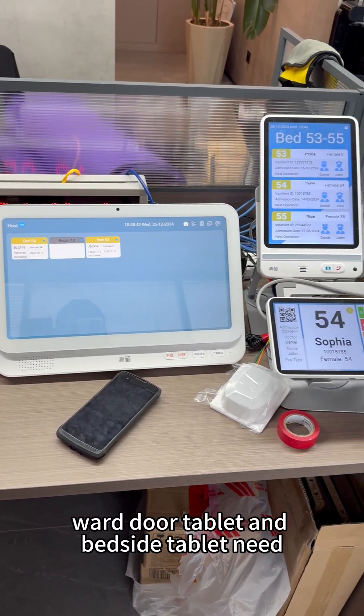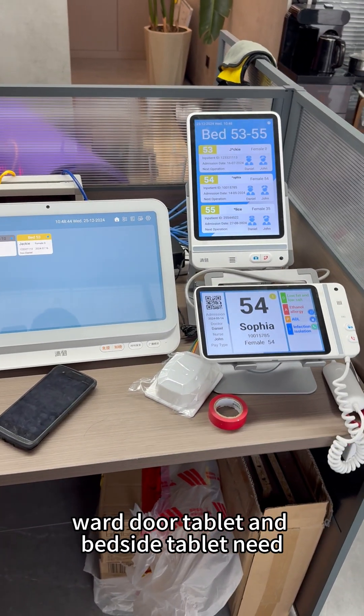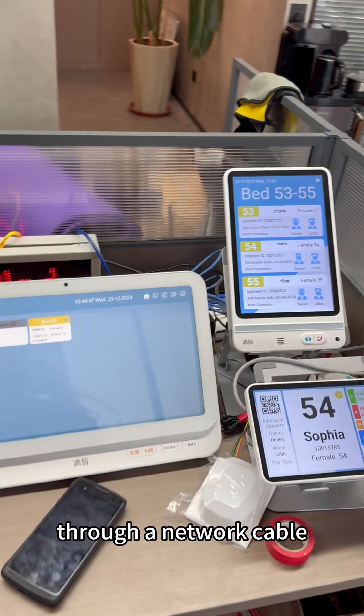The nurse call host, ward door tablet, and bedside tablet need only connect to the PoE floor switch through a network cable.